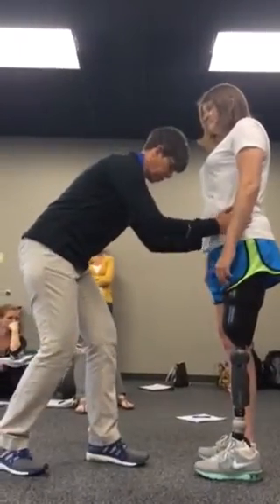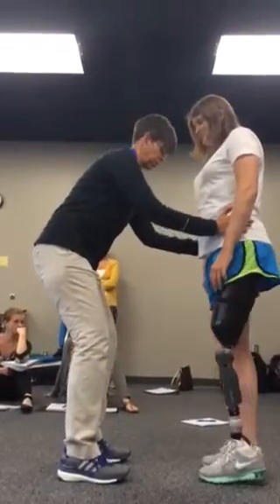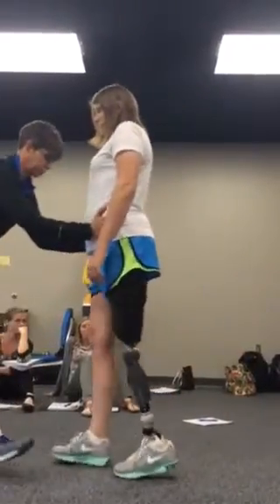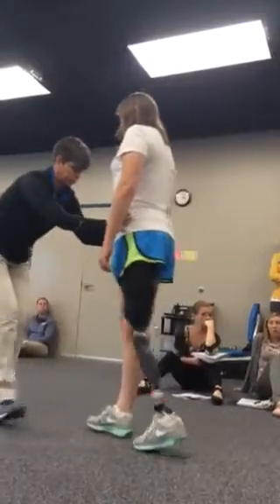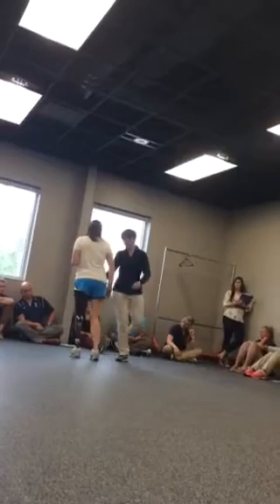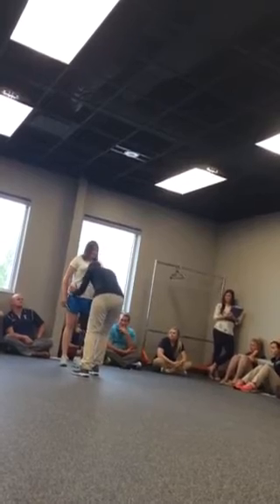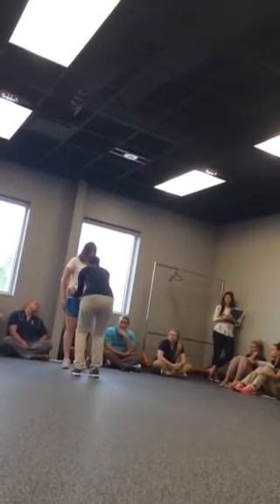So I'm going to get her going. I'm going to put my hands here, and I'm just going to walk with you. I'm not going to get in your way. Go ahead. And I'm going to see where my hands go. You can walk faster. I'll get out of the way. I promise. Right? You see what? I'm not sure if it's you or me that's a problem. All right. I don't know if you guys can see that. Watch my right hand. All right, go ahead. I'll get out of the way.